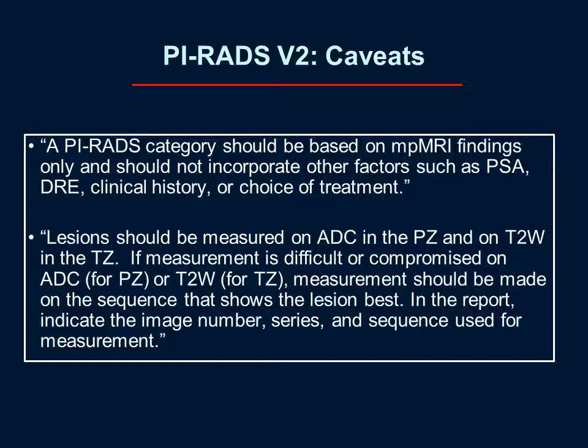Just a couple additional statements from PI-RADS of relevance. Quote, a PI-RADS category should be based on MP-MRI findings only and should not incorporate other factors such as PSA, DRE, clinical history, or choice of treatment. Again, we should be reporting what the images show.